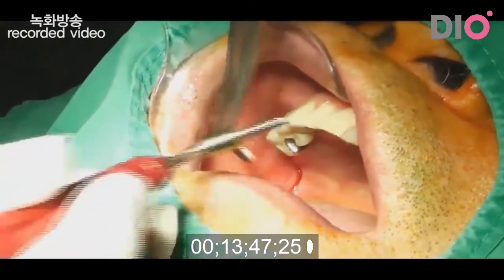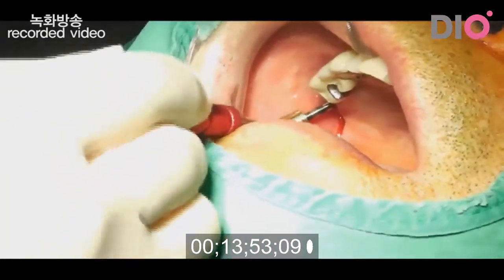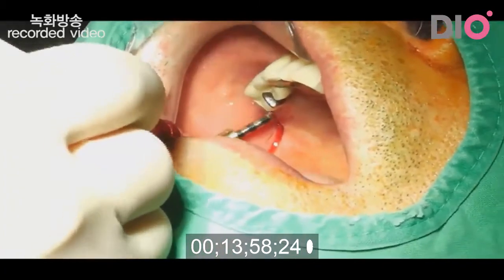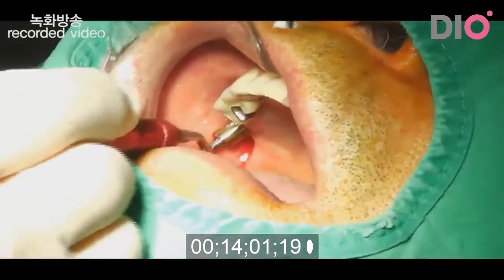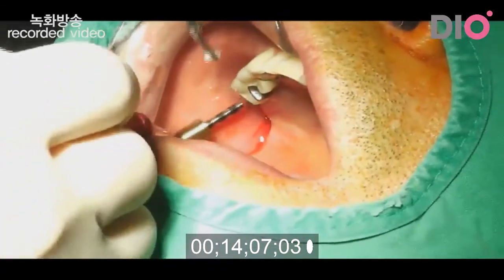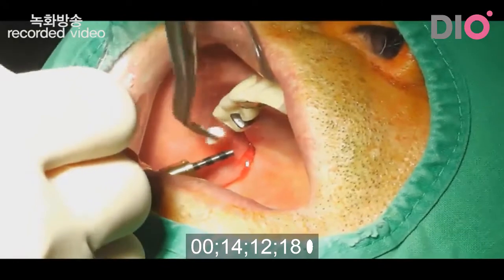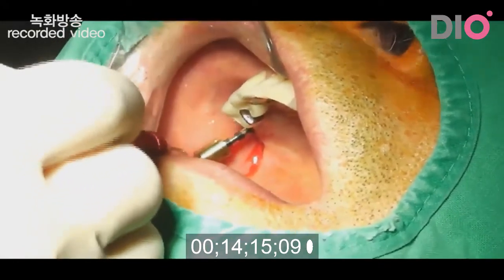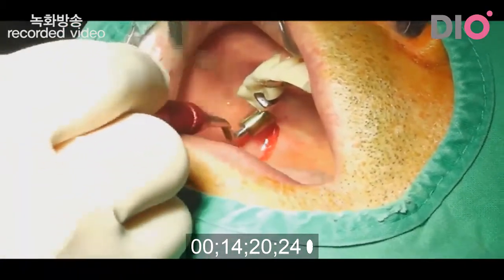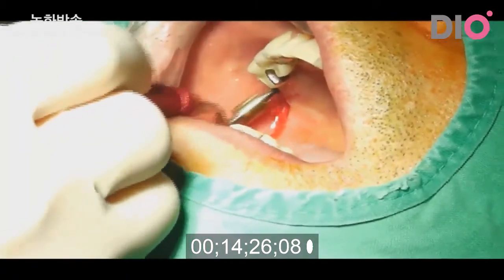Okay, another one. The other half of the collagen sponge will also be inserted into the sinus cavity. Okay, this is a very simple procedure to insert the material into the sinus cavity using this bone plugger.